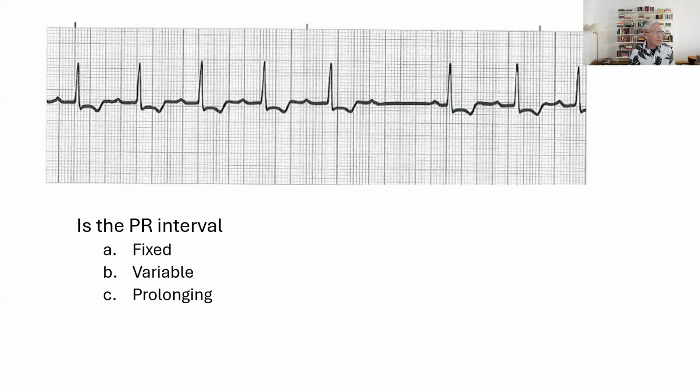Notice this ECG. Are all your P waves having a partner? Okay, no. So let me help you. P, QRS, T wave. P, QRS, T wave. P, QRS, T wave. P, QRS, T wave. P, QRS, T wave. P, P, P. Does it have a partner? No partner. What is our diagnosis? AV block. Very good. Okay, next.